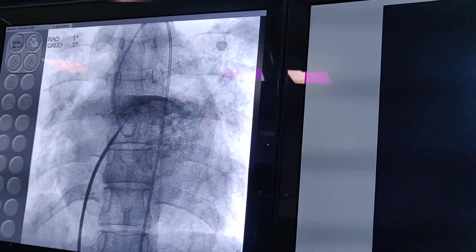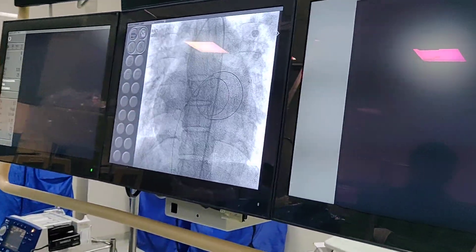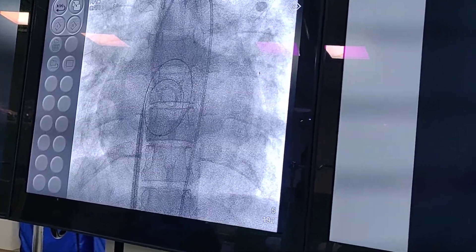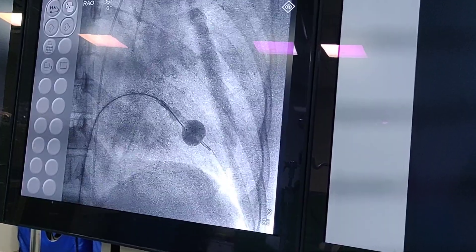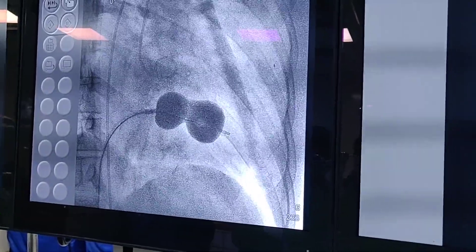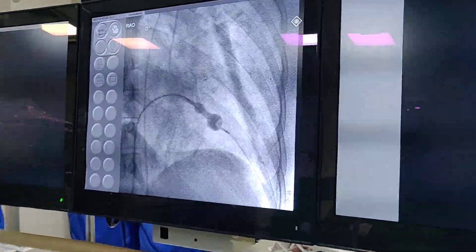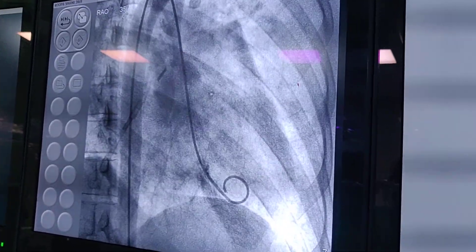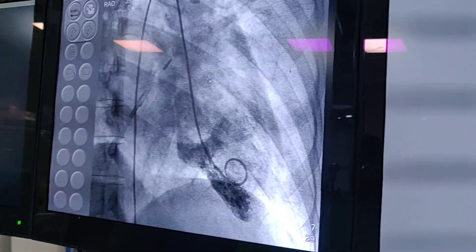At the lower level puncture, when we did this, the balloon went very smoothly. The wire is inside and we are dilating the septum with the dilator. Then we took the balloon — this is the balloon in the left ventricle and the balloon is getting inflated. The balloon got completely inflated and the valve has opened up nicely. We then took an angiogram after finishing the procedure and this is a very good result of valvuloplasty. The LA pressure from 35 has come down to about 11-12 and there is no mitral regurgitation. Very good result, successful.